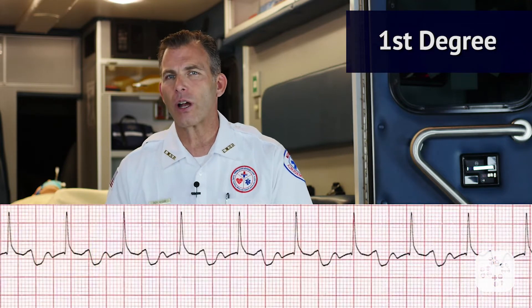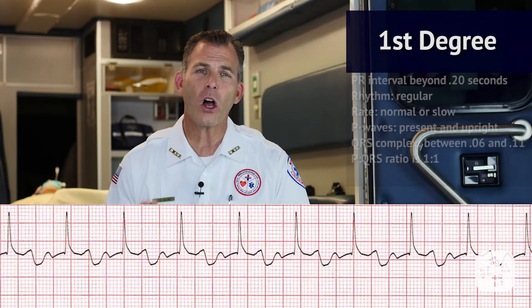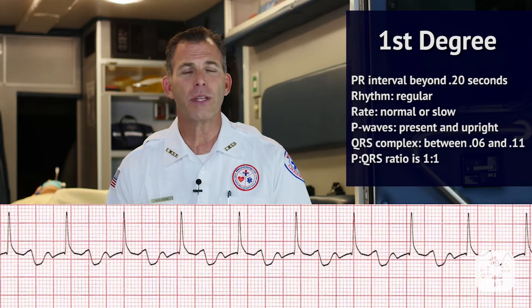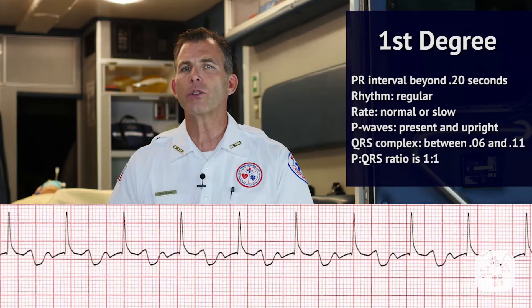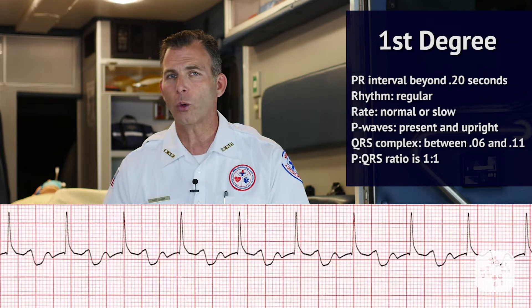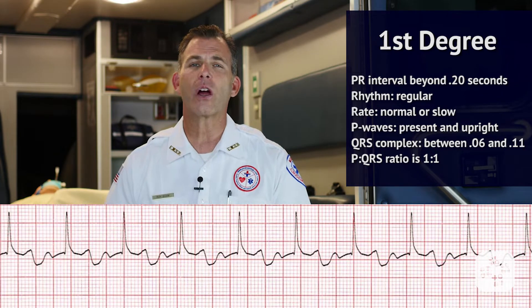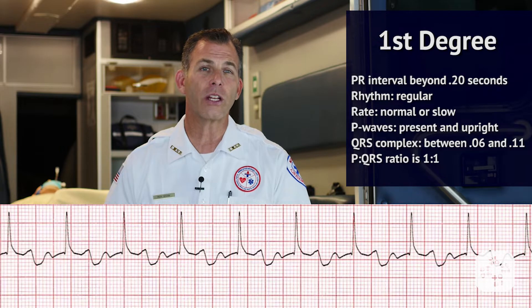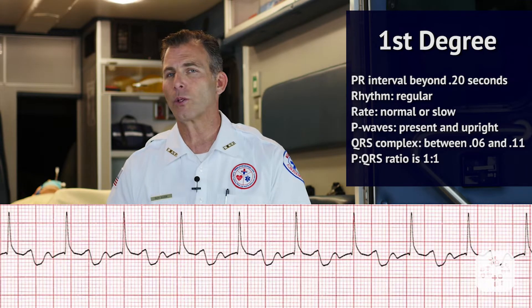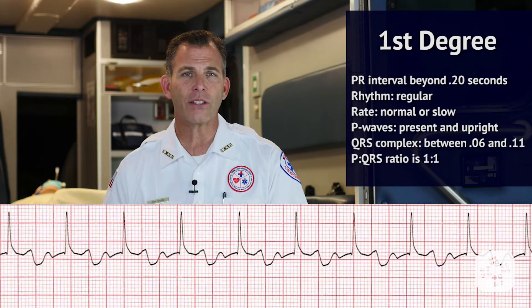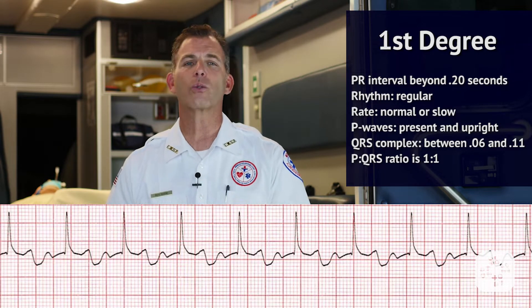First degree AV block is described as having a prolonged P to R interval beyond .20 seconds. The rhythm is regular with a normal or slow rate. P waves are present and upright with a P to R interval greater than .20 seconds. The QRS complex is between .06 and .11 seconds and the P wave to QRS ratio is 1 to 1.